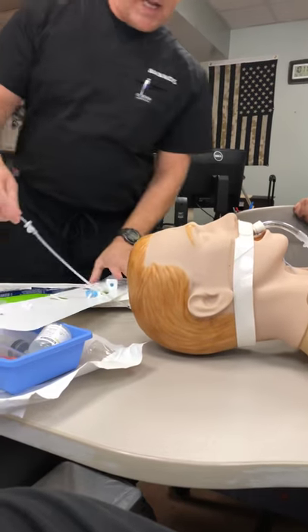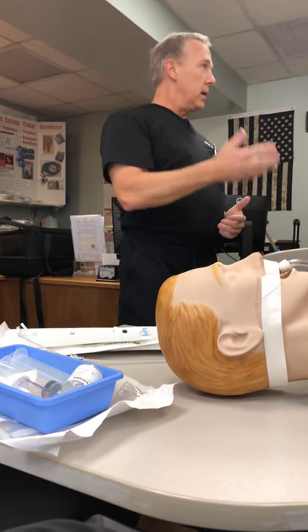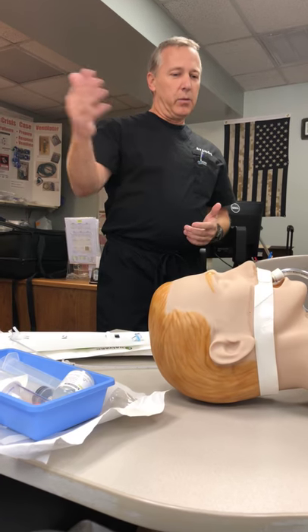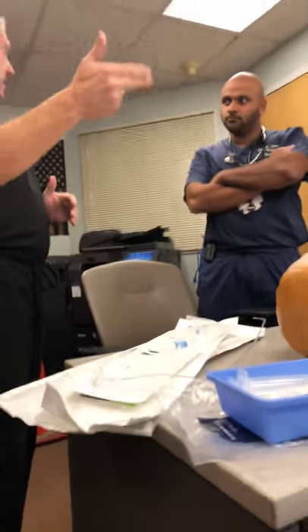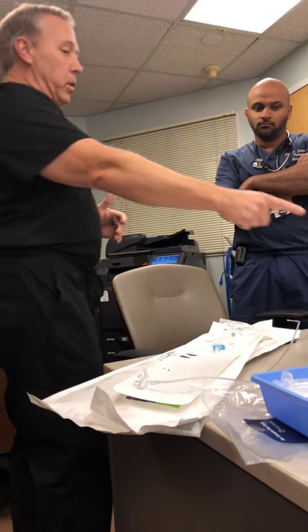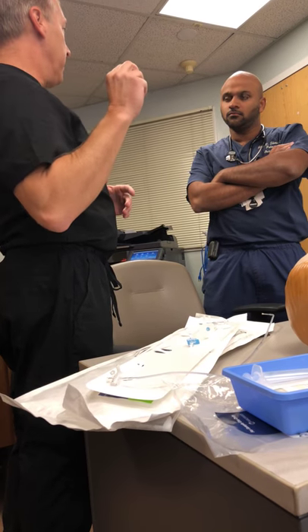As far as setting up for the procedure, what we would do is, if you guys ordered a mini-BAL, RT would come to the bedside, they would talk to the nurse and make sure that the patient's okay with running it. What we would want to do is turn off the feed for 30 to 60 minutes prior to doing the procedure. We'd want to hyperoxygenate, and we'd want to go ahead and do a closed suction pass before we do the mini-BAL.